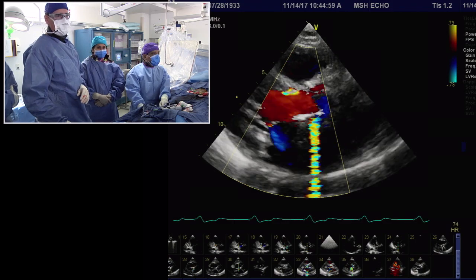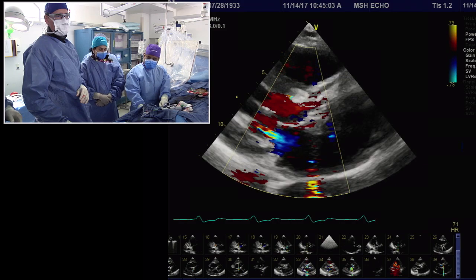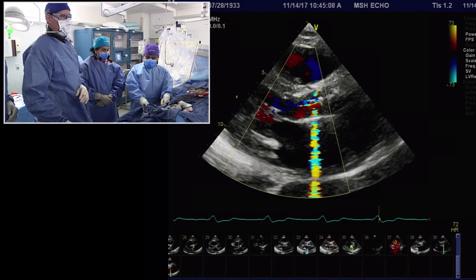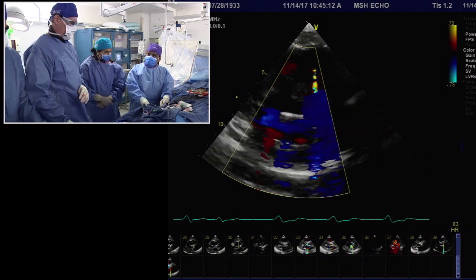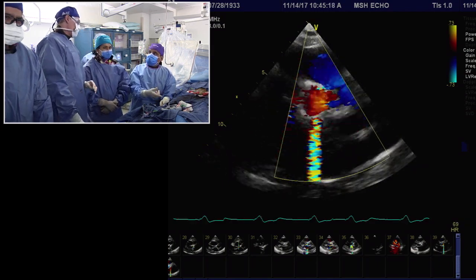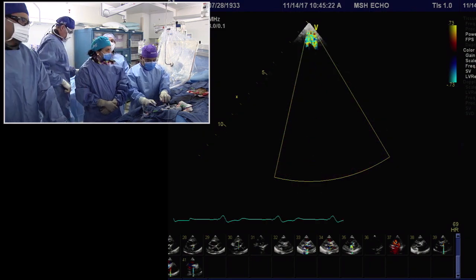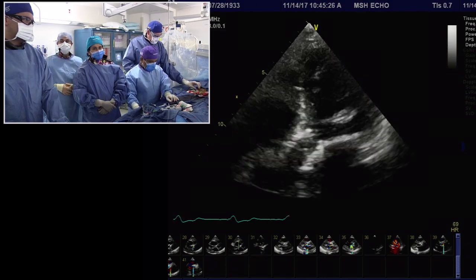So a question we are getting is: is the Confida wire exclusively used in all cases of TAVR in our lab? Let's ask our fellow Farhan. What do you think? Every case? Yes, every case that we do, even now the balloon valvuloplasties. We started using it in BAV. The wire is very expensive, about six times more than your stiff wire. But clearly, it's better tolerated with less perforation, so that's the big advantage.